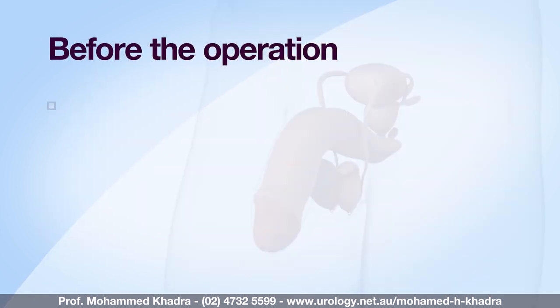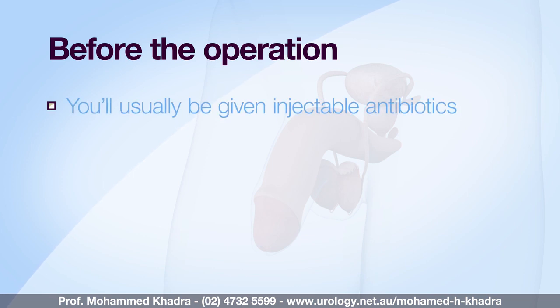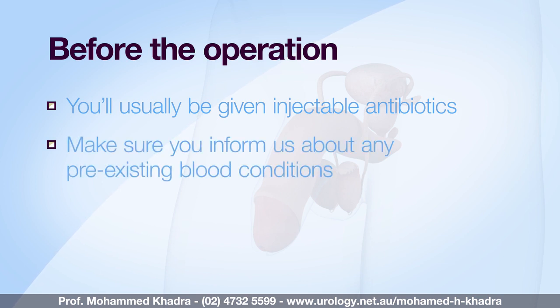You will usually be given injectable antibiotics before the procedure after checking for any allergies. Make sure you inform us of any blood thinning medications or conditions that may affect how we perform the procedure and how you will heal after the procedure.